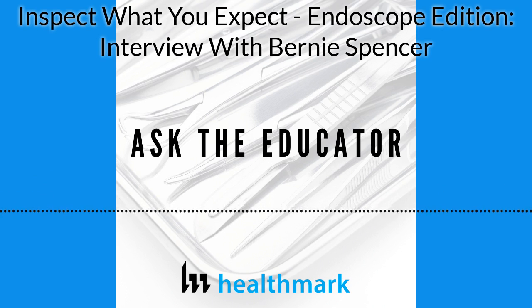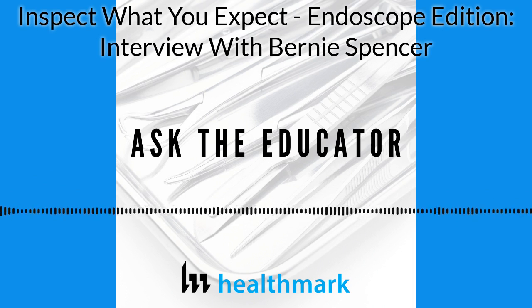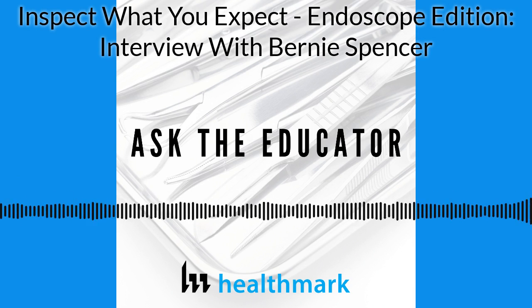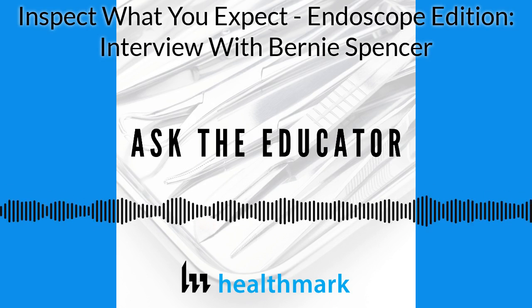And after the repair, the scope didn't have another test failure until almost 40 patient procedures later. And over the long term, after the repair, its failure rate fell in line with other scopes. We had a similar situation with an EGD later in the study. Now, I'm not implying that scope damage is the only reason for a test failure, but in my opinion, it has a significant influence. Absolutely.